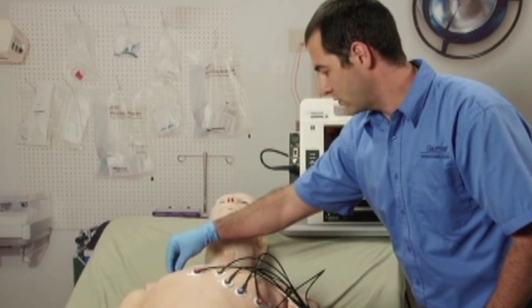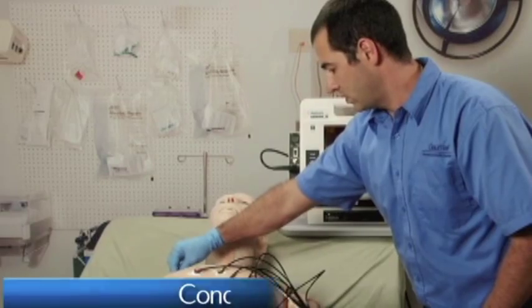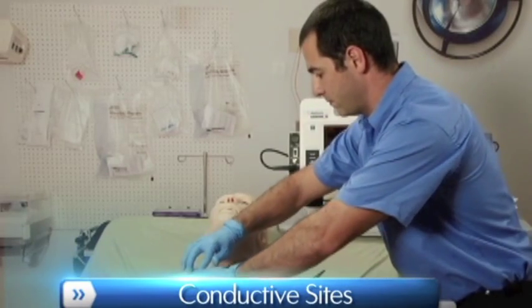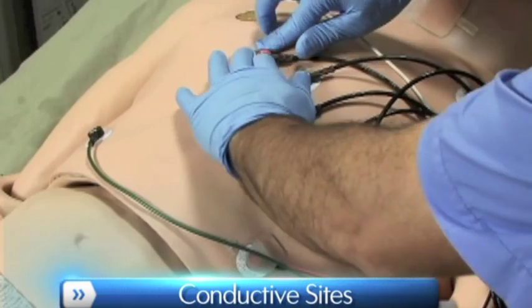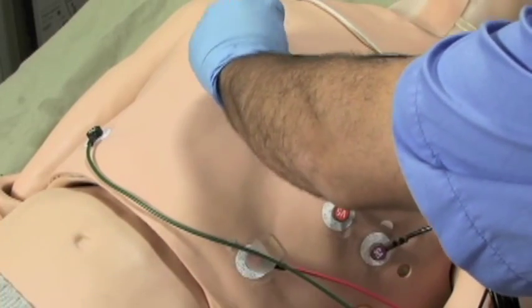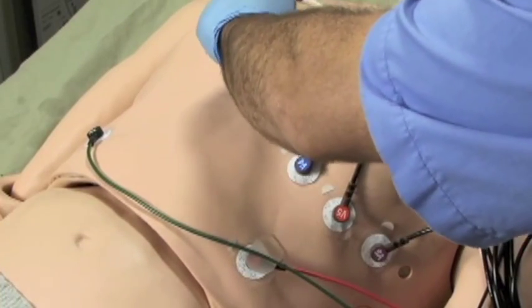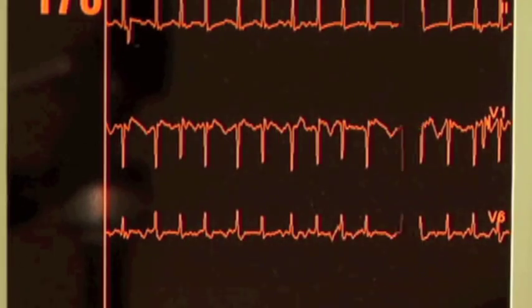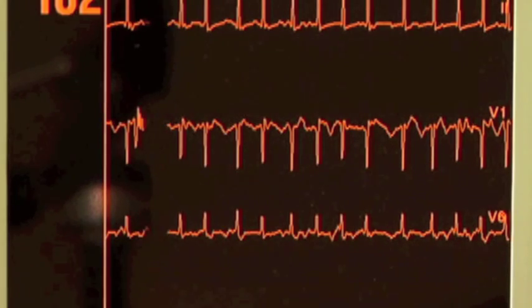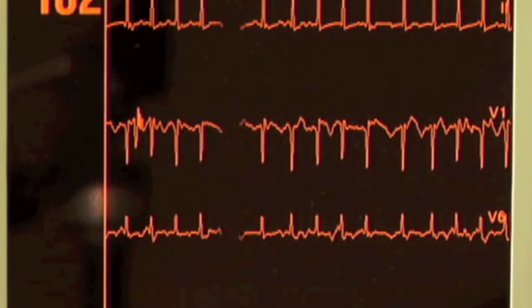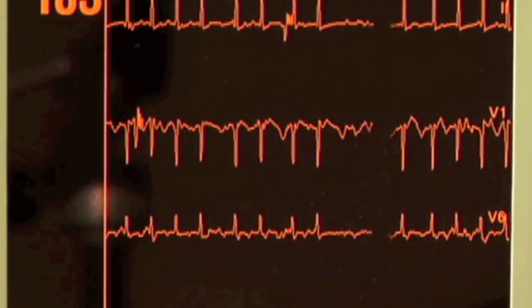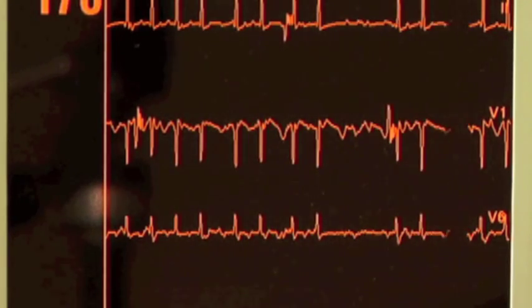HAL is equipped with 10 conductive sites to allow the use of a real 12-lead ECG monitor. View ECG rhythms for each of the 12 leads. This feature permits the user to track cardiac rhythms and events with their own equipment, just like with a human patient.